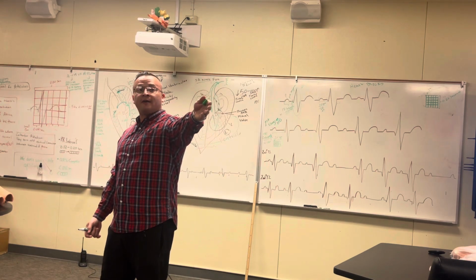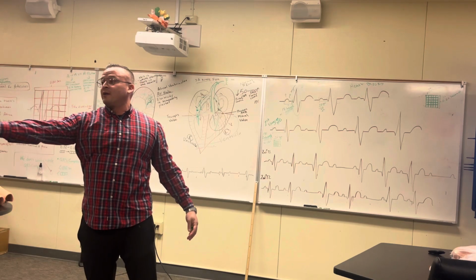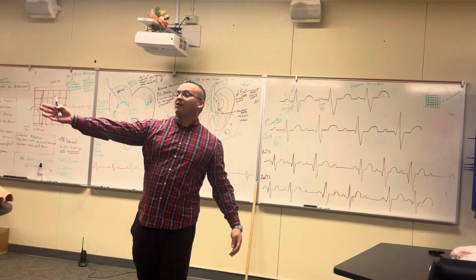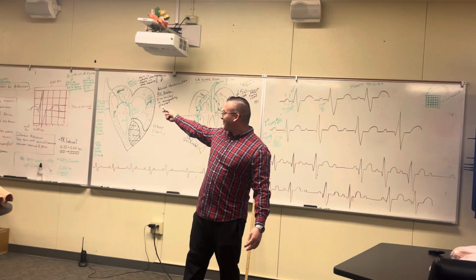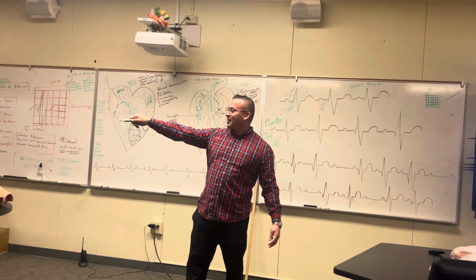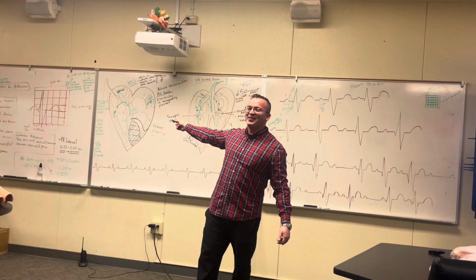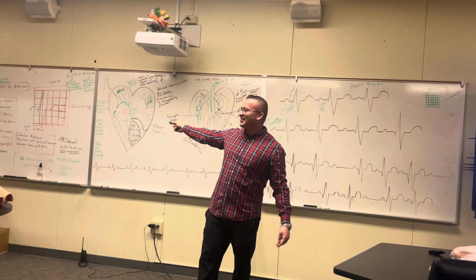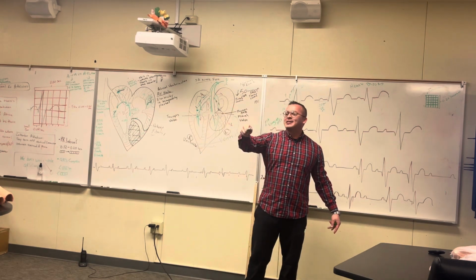It also means that it's wider than 5 little boxes. So it's also wider than one what? 5 little boxes equal what? It's wider than one big box, right? Because one big box is 5 little boxes.